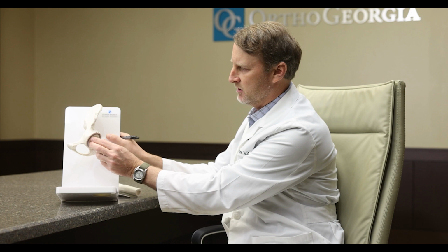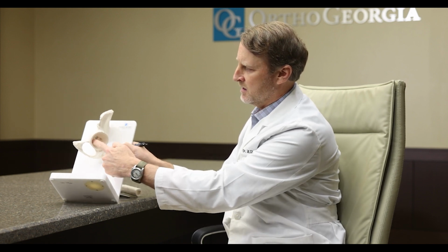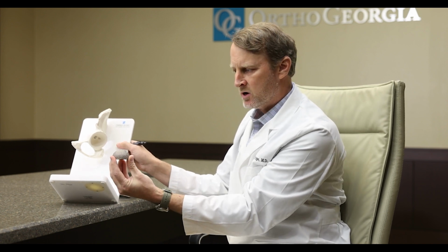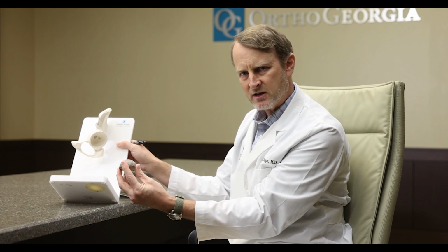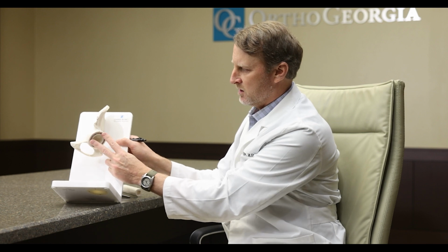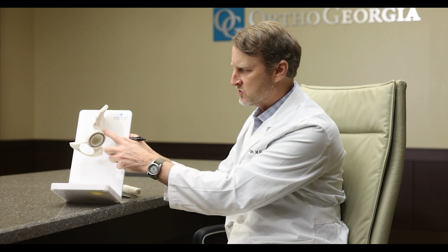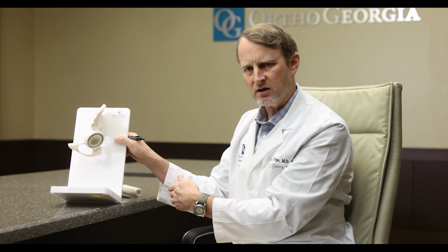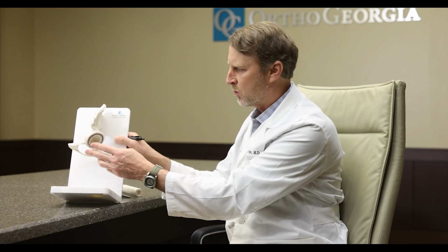This is a model of the pelvis. The pelvis is then reamed sequentially to a size appropriate for each individual, and a metal cup with a real porous trabecular metal on the back side of the cup is mounted into the pelvis. There are typically a hole or two in the cup if a screw were to be needed for fixation. Usually that's not necessary. Usually only about 10% of the cases are screws required.